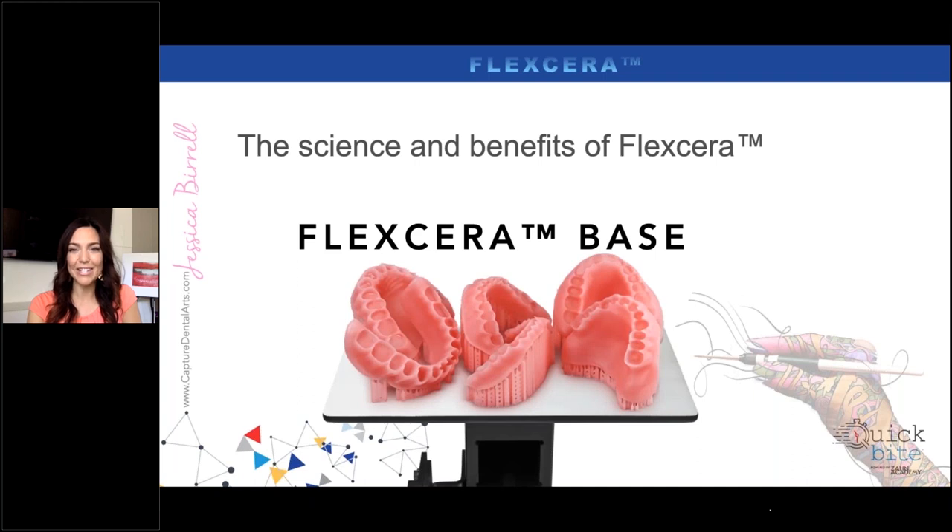The Flexcera base is the denture base material, and it was really fun for us to experiment with the first time. My team and I were so surprised with how easy this system was. The material itself feels kind of soft and squishy — you can feel that flex to it. We printed out the base, put it through the alcohol bath, put it through the curing unit. Most of my team still felt like, well, is it really cured all the way? Because it still felt kind of soft and pliable. But if you try to squeeze it and bend it, it doesn't move — it still feels like it has a soft consistency. It really is a flexible feel, and that's hence the name Flexcera.